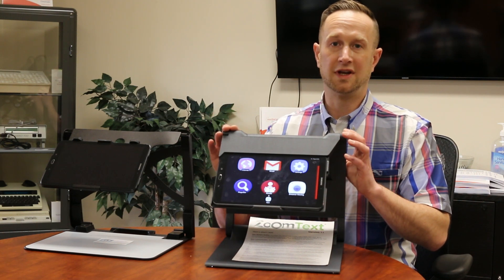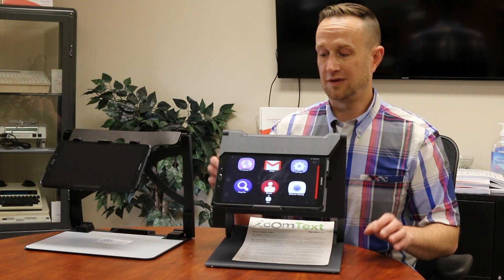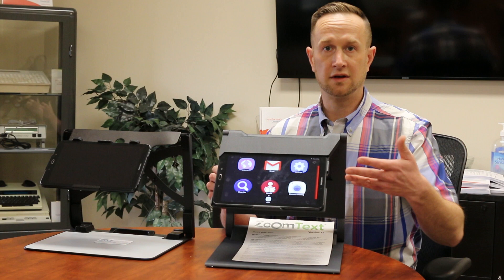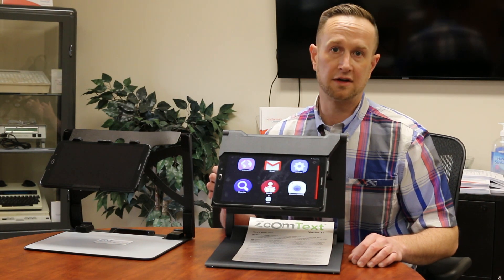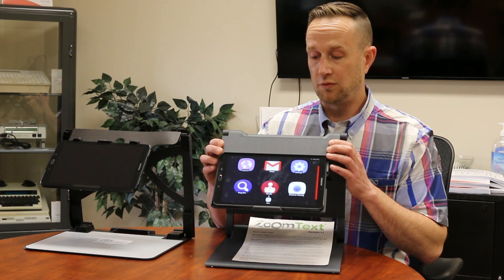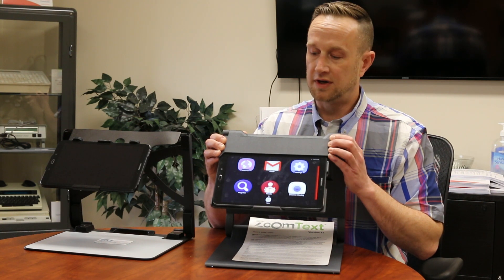This is a close-up desktop video magnifier, it has OCR, it also has distance magnification, in addition to being a tablet that can connect to the internet, so you have all the internet accessibility. You can connect to your email, you can surf the web, and you've got the App Store, so you've got all of these applications right here.